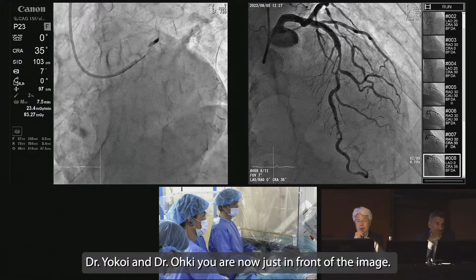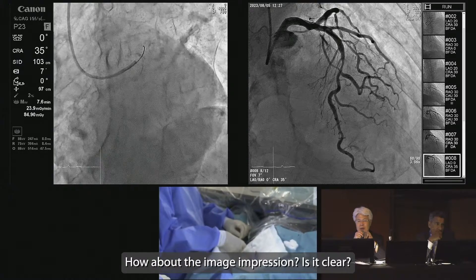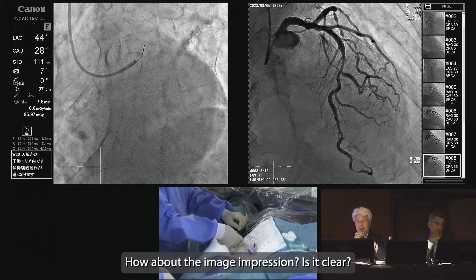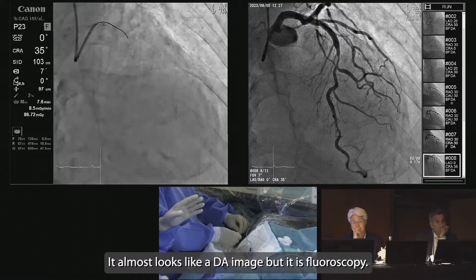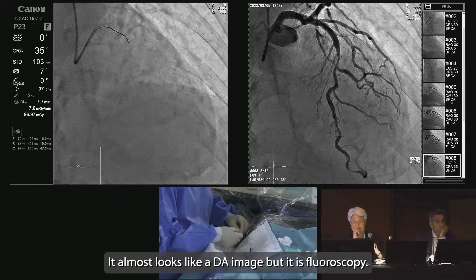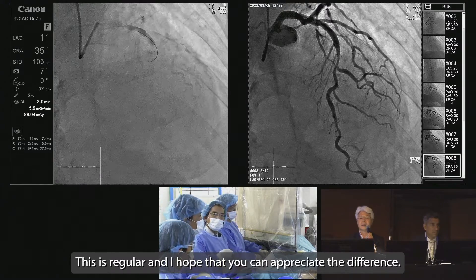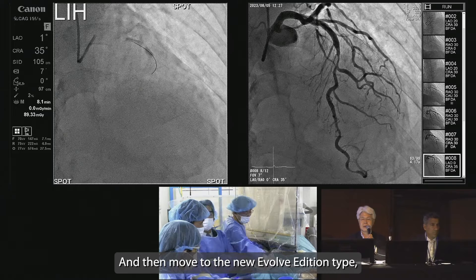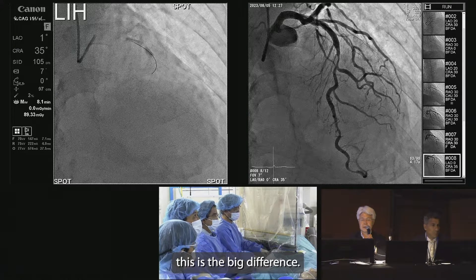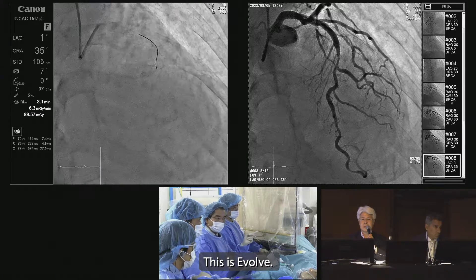Yokoi-sensei, you are now just in front of the image. So how about the impression? Is it clear? Very clear. It almost looks like a DSA image, but it's fluoroscopic. This is the regular image, and I hope you can appreciate the difference. And then moving to the new Evolve Edition — this is a big difference. This is Evolve.